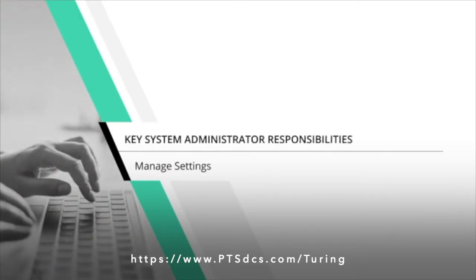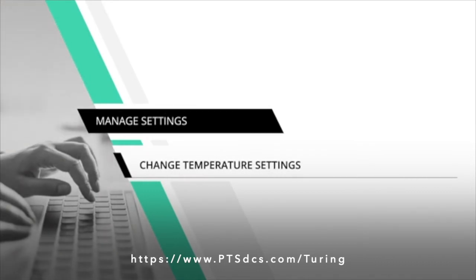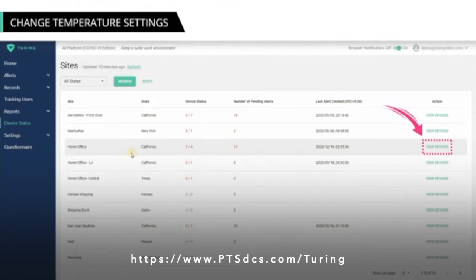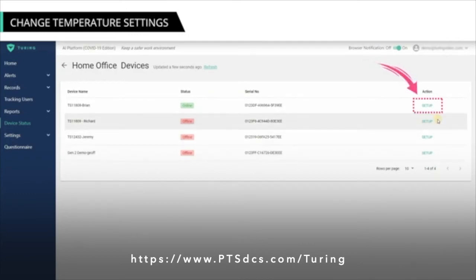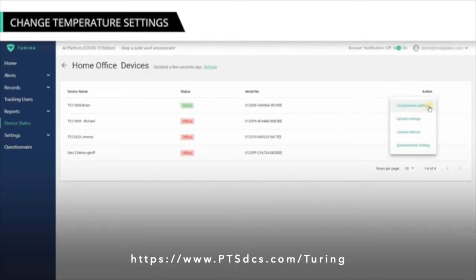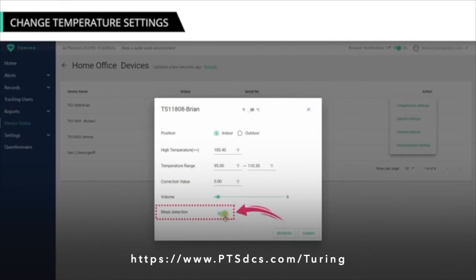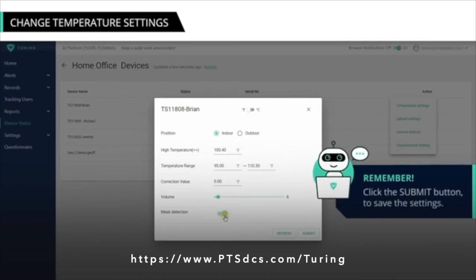As a system administrator, you can also manage devices, temperature settings, outdoor and indoor settings, and volume settings. To change temperature settings, the device status menu takes you to the sites page. You can change temperature settings for your devices by clicking the View Devices link under the action next to your device. All the devices for the site will display. Click the Setup link, then click Temperature Settings. The overlay box for the selected device appears, allowing you to change the temperature settings. If mask detection is turned on, the scanner will check if the individual is wearing a mask. This is also where you can manage the high temperature reading for a specific device. Once you make changes, click the Submit button.